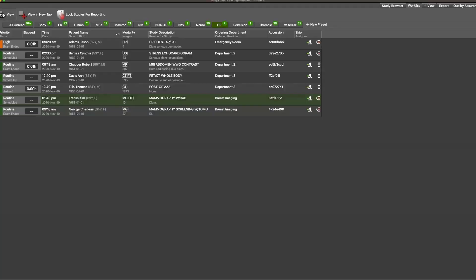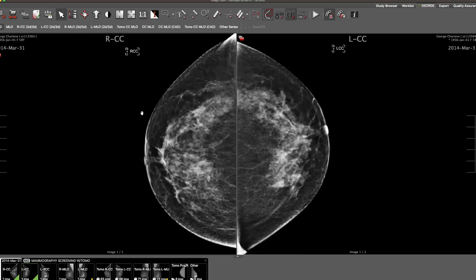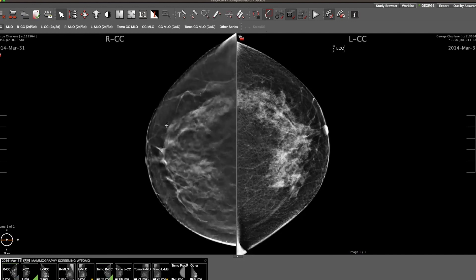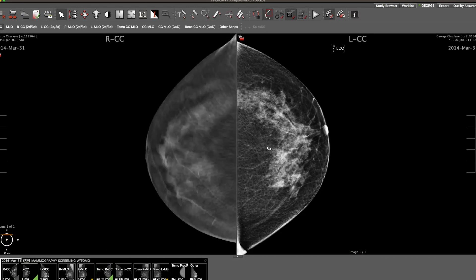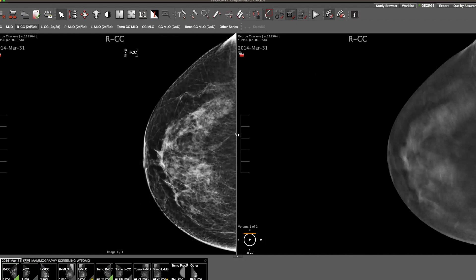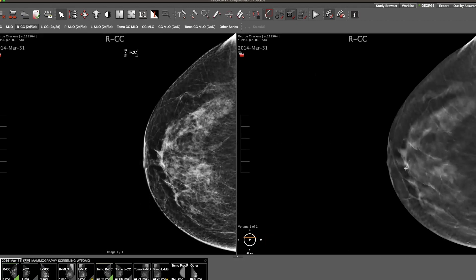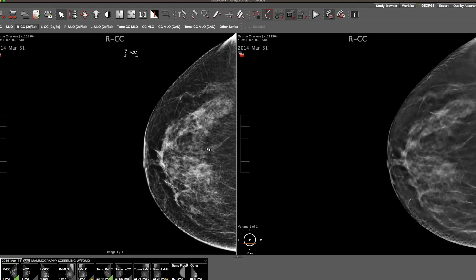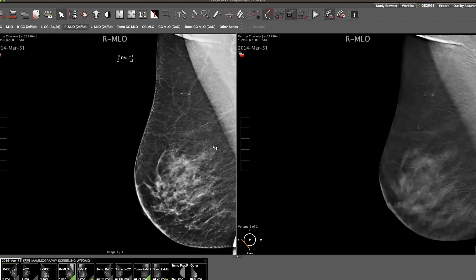Finally, we'll head back to our work list and load our last mammography study of the day. Here we have a tomosynthesis study. We're in our CC view. I do have a hot key set up to toggle between my 2D and my tomosynthesis data on any image, and then toggle back and continue using my keyboard shortcuts to advance through various layouts. Here's an example of the 2D on the left and the tomosynthesis on the right. I can use that same hot key on my 2D image to toggle also between the 2D and 3D views and then continue through my workflow.